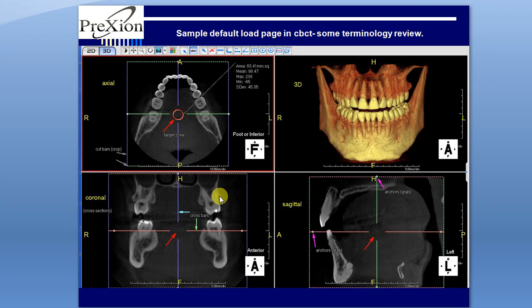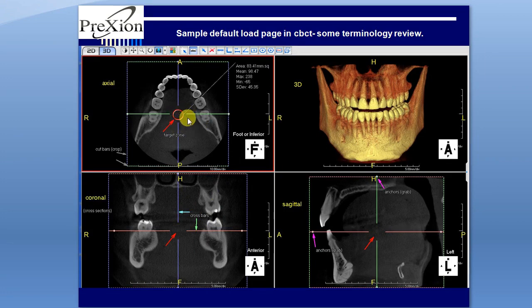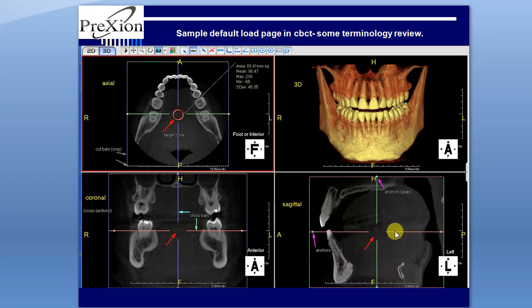For a quick overview of terms, we will note the crossbars. In between the crossbars is called a target zone. The crossbar has lines and if you look at the circles, these are grab points or tilting points. Note your planes: axial, coronal, sagittal, and your 3D rendered image in the right hand corner.